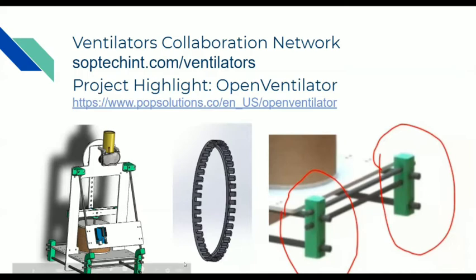The rotary encoder, you can see, is this middle disc that goes behind the crankshaft, the disc connected to the motor, the lever. The good part of this encoder is that it is found in those school kits of Arduino.